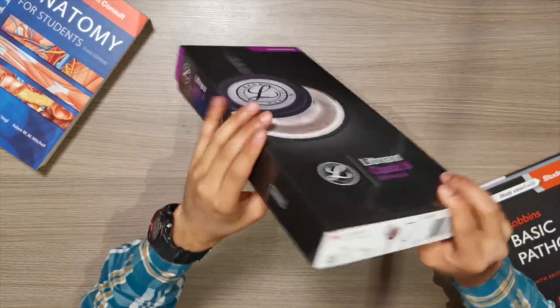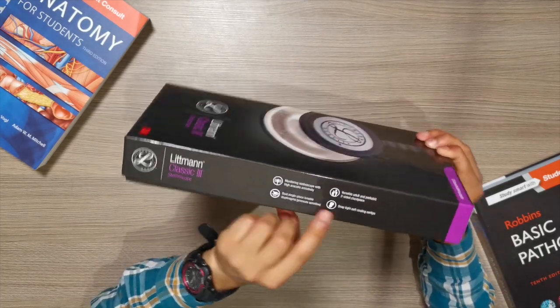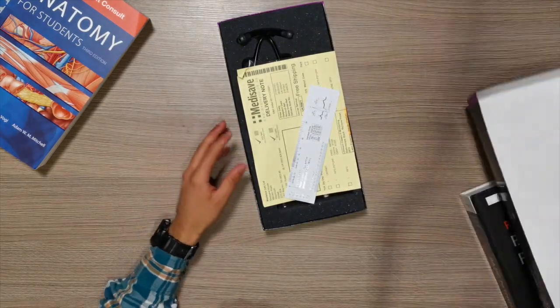So let's get into it. As you can see here, this is the box — this is how it looks from the side. It shows the model, the color, a few features, and so on. Very simple, typical Littmann box.